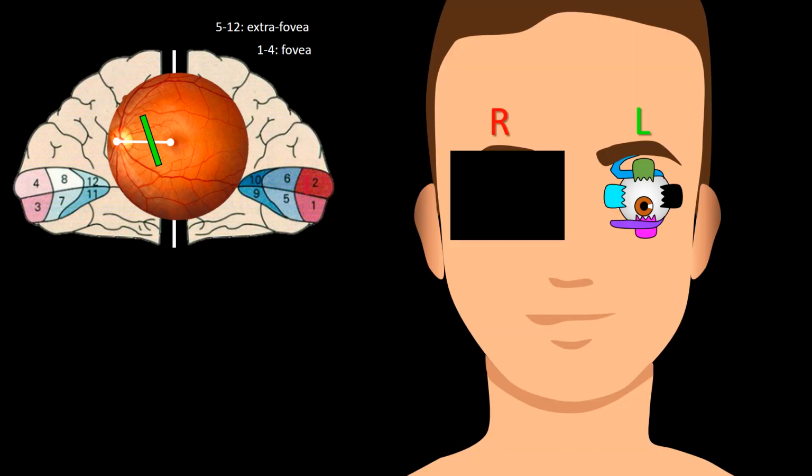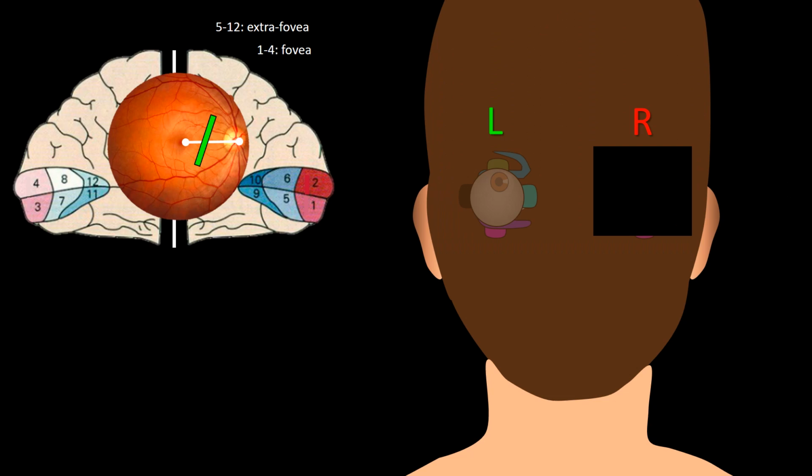The last step we have to follow to understand the bar position in the chart relates to the perspective the chart is plotted. Here, the head is presented face forward. We need to turn it, as illustrated here, to comply with the mode diplopia chart is represented.